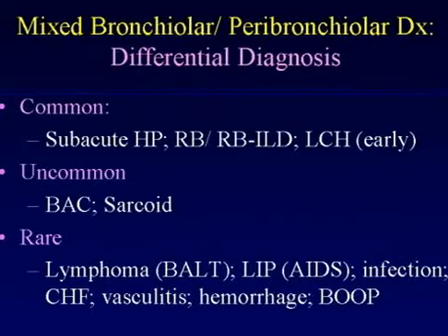But that same entity can then become a diffuse interstitial lung disease, so-called respiratory bronchiolitis interstitial lung disease, which is one of those alphabet soups that I didn't get to because, frankly, you can wait a couple of years before you'll see one, and you're not going to make the diagnosis anyway. The pathologist is going to make it. The other thing you might want to think about, and I'll show you some examples, is Langerhans cell histiocytosis, and that'll pretty much cover most of the important diffuse lung diseases you're likely to see.